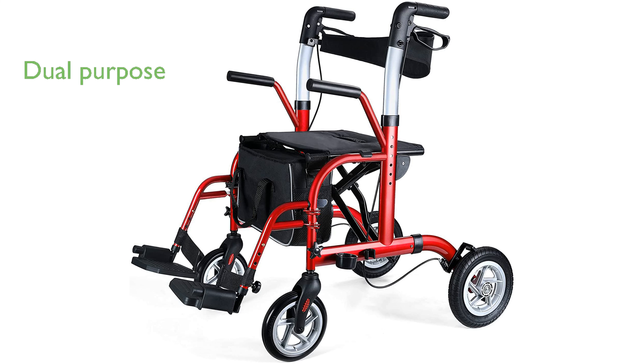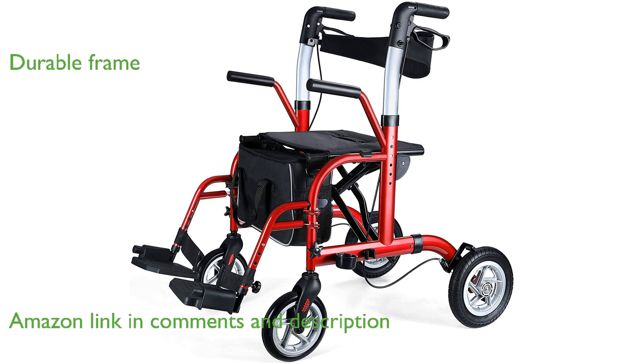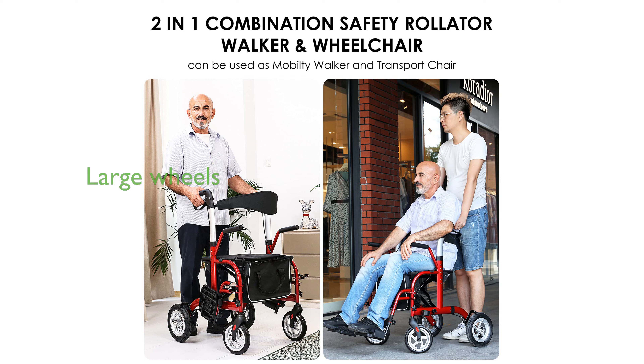The HeelConnects 2-in-1 Rollator Walker serves a dual purpose, making it ideal for both walking and transportation for seniors. Its durable aluminum frame and high-quality construction ensure longevity and reliability for elderly and injured users. The large 10-inch pneumatic rear wheels provide superior stability and maneuverability on various terrains, from gravel to grass.